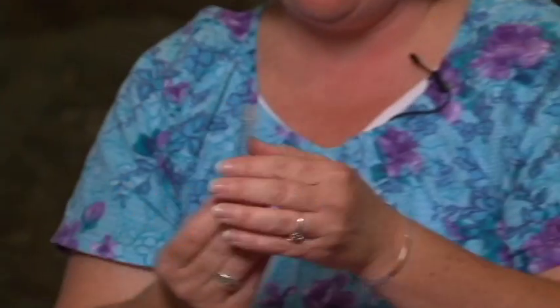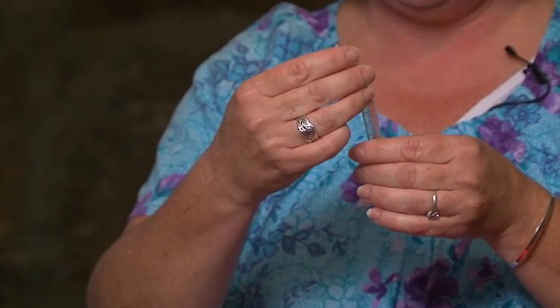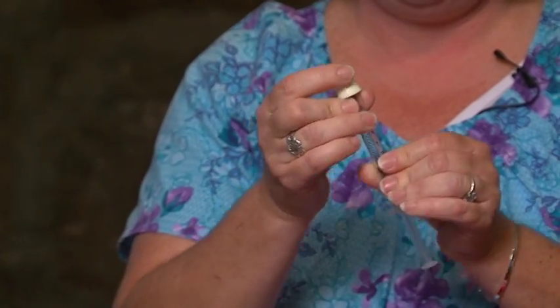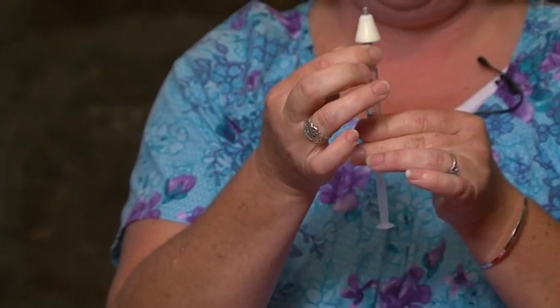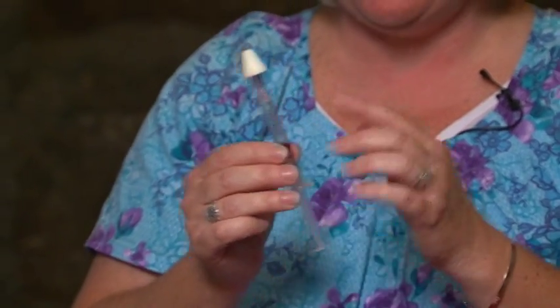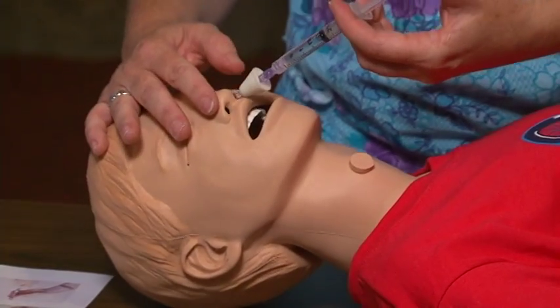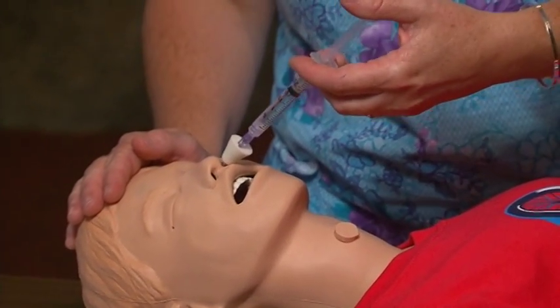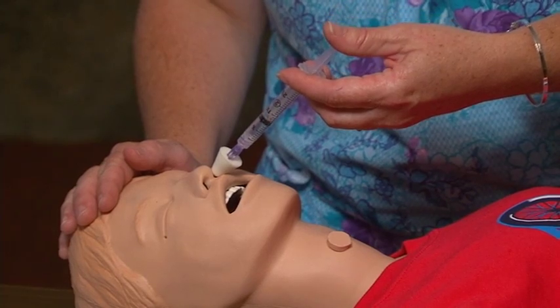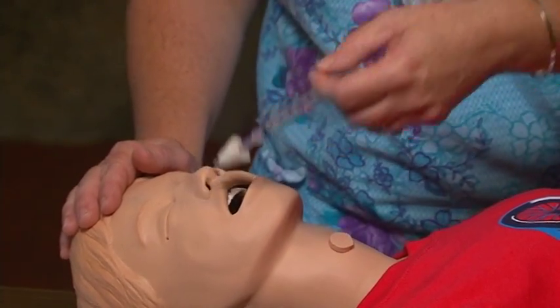You then take off the needle and you put on the MAD device, and it just screws right on. And then you administer half of the dose in one nostril, half into the other. And you do a brisk push, and you do not need to squeeze or pinch anything. One nostril, then the other nostril.